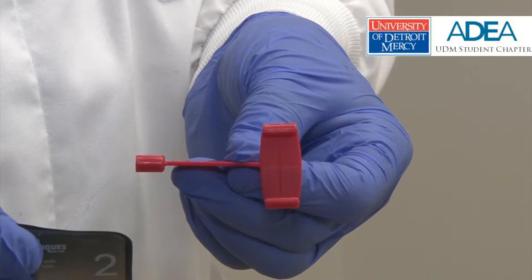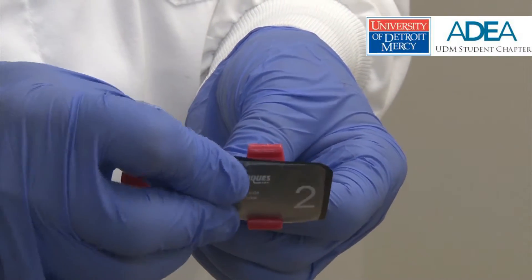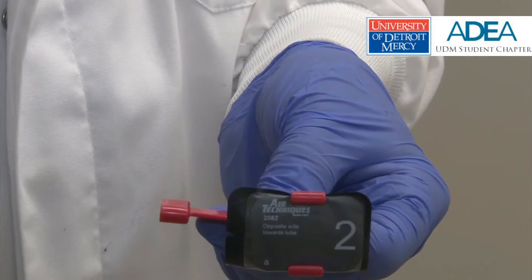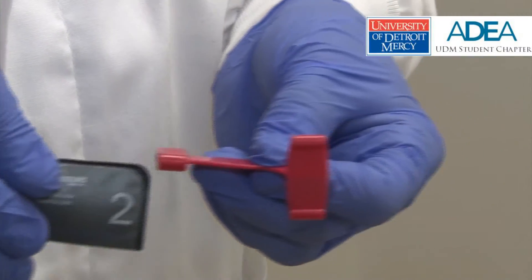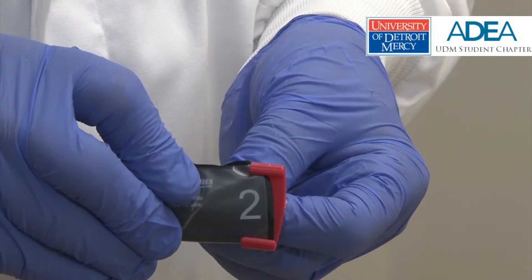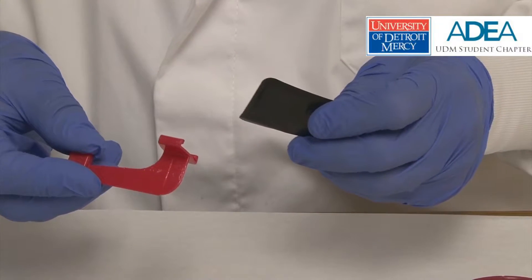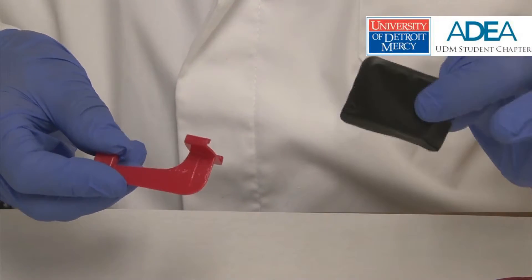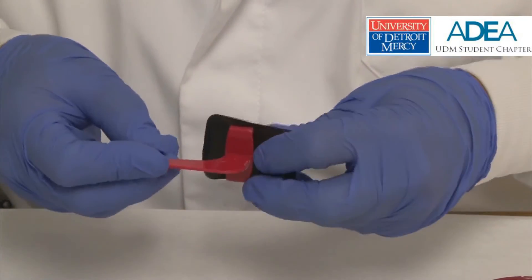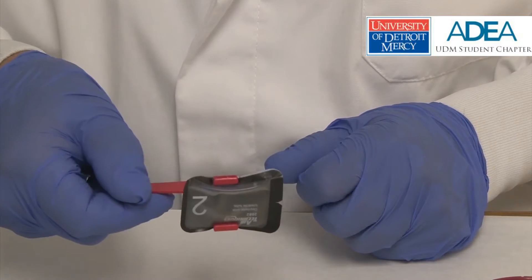For bite-wing radiographs, the number two sensor is placed in the holder by adapting it to the ledge, giving it a slight bend, and snapping it into position. If the student tries to slide the sensor into the holder, it will cut the sleeve and violate the infection control protocol. In the bite-wing holder, it seems contrary, but the black image side of the sensor sleeve is placed against the plastic holder, and the logo side is fully visible.